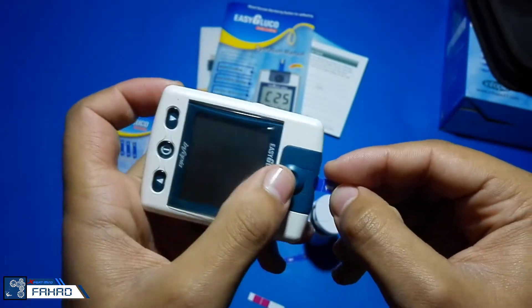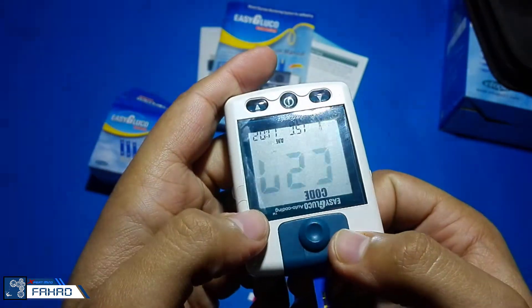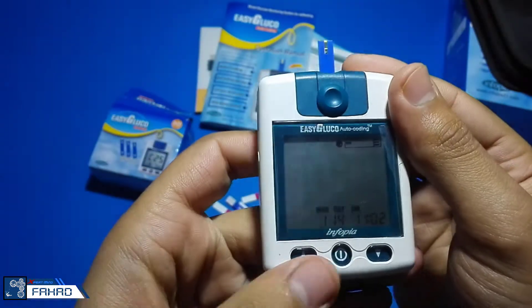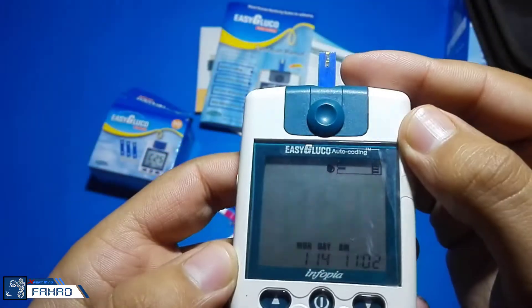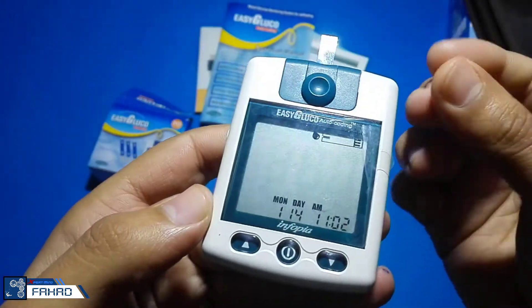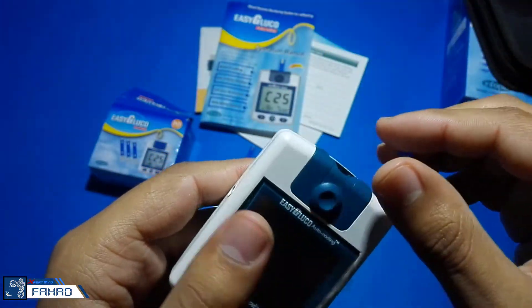I am inserting one strip into my glucose meter. First it will recognize its code, and then it will indicate for blood. When you put the blood on that strip, it will show you the glucose sugar level in the blood.